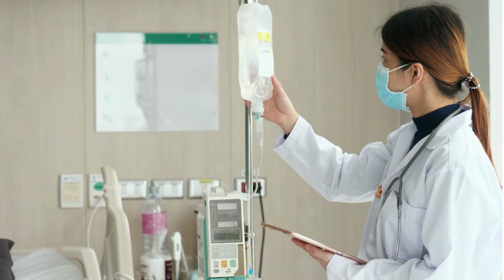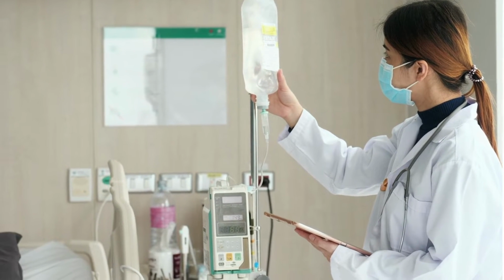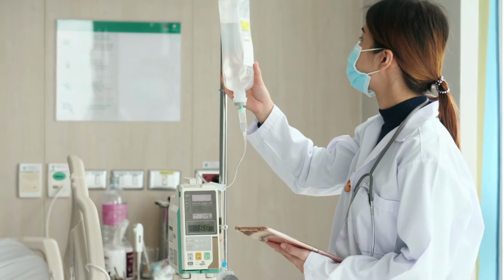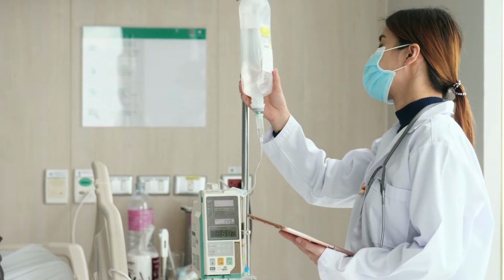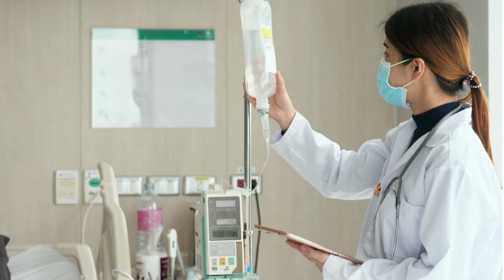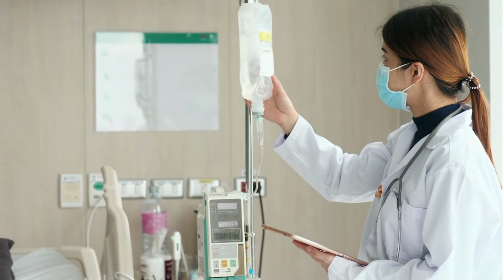The procedure is done under conscious sedation. We do not knock you out or put you under. We give you enough to make you comfortable. If at any time you feel anxious or any pain or anything like that, we can work with you. The procedure itself is not painful, but we do try to make you as comfortable as possible.